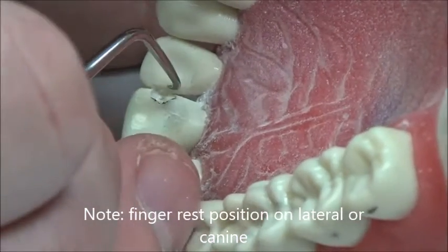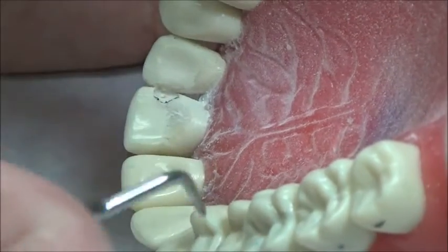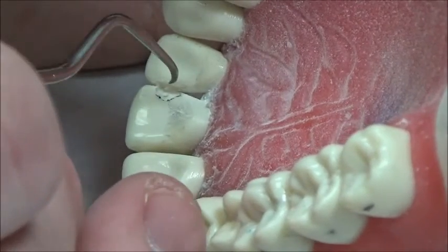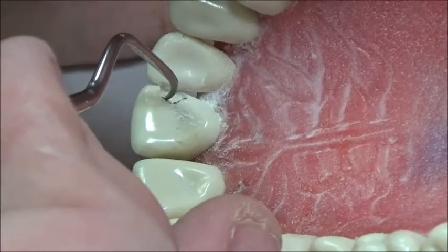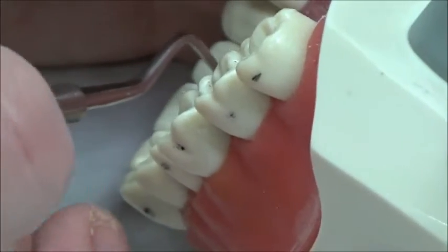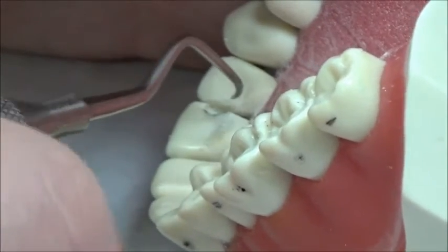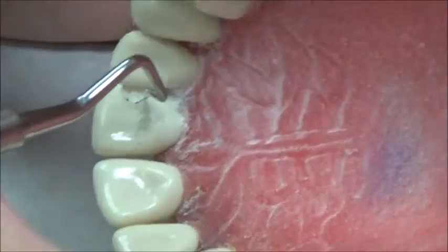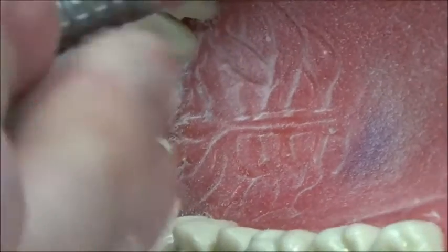Right now we can see we're probably a little long — this is closer to 3 millimeters rather than 2. The axial depth is okay, and our facial-lingual depth is about 1 millimeter if I had to eyeball it. We want to just barely break contact, so I'll drop down a little bit in the safe portion of the prep.